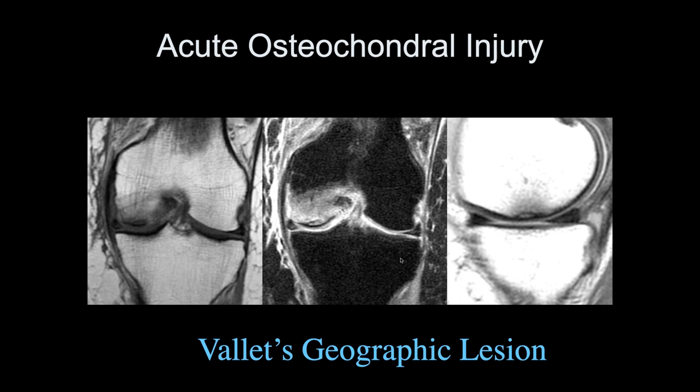Jennifer, what do you think of this case? Okay, so here again, we can see some linear decreased signal intensity paralleling the subchondral bone plate along the medial femoral condyle, and there's diffuse surrounding edema. So this is acute osteochondral injury. Yes, right. And this involves the immediate subchondral bone here.